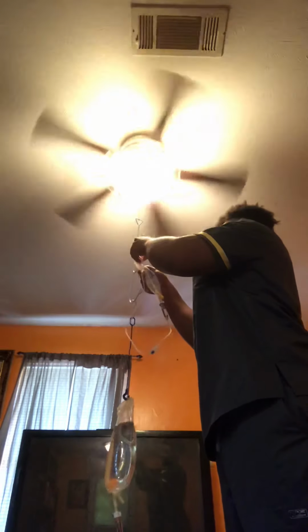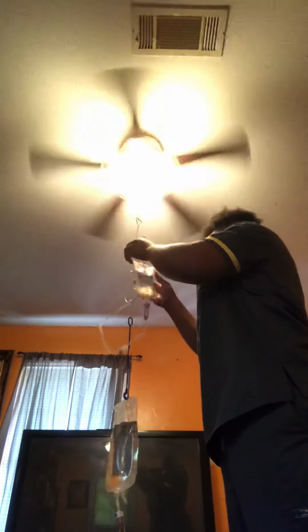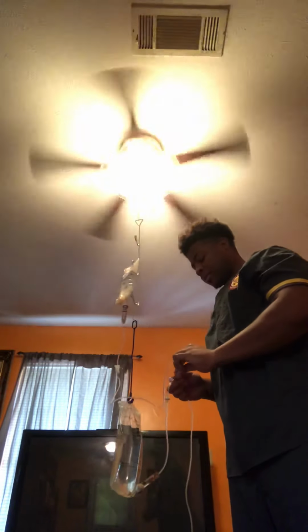So let's go ahead and hang this. And then you would clean this for 30 seconds while keeping sterility. And then you would unattach that cap, dispose of this, and connect these together. And then adjust this to drop at 21 drops per minute. And then that's it.